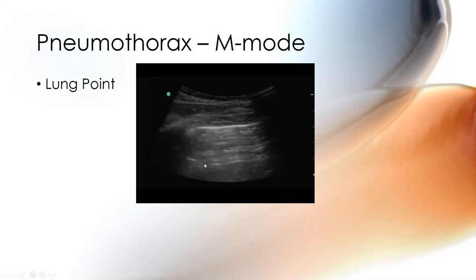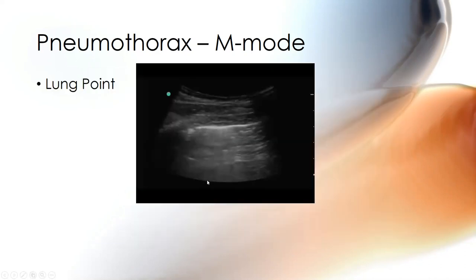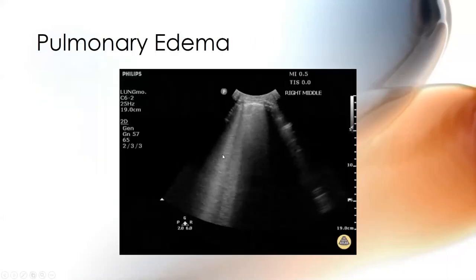It's wherever the lung stops normally. So where does the lung stop normally? At the bottom, right where the diaphragm is. If you remember the picture that I showed you way back at the beginning of this talk of the curvilinear probe at the posterior lateral point where the liver really comes in and out, that's kind of a lung point, right? Because the lung physically ends. There is no more lung, but I don't know if that is helpful to you all thinking about how a lung inflates and deflates. All right, let's move on.